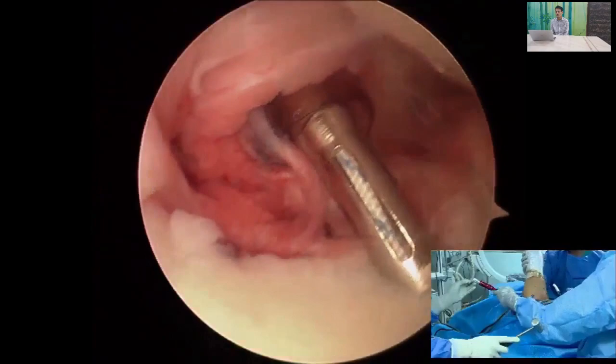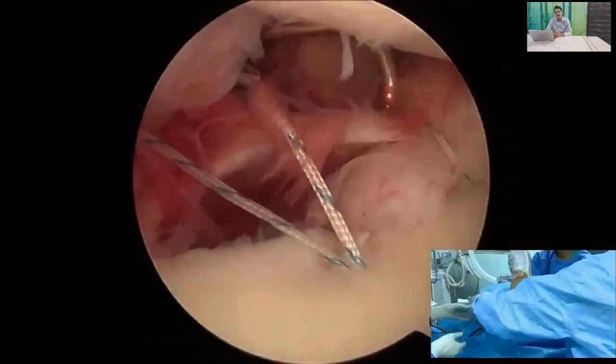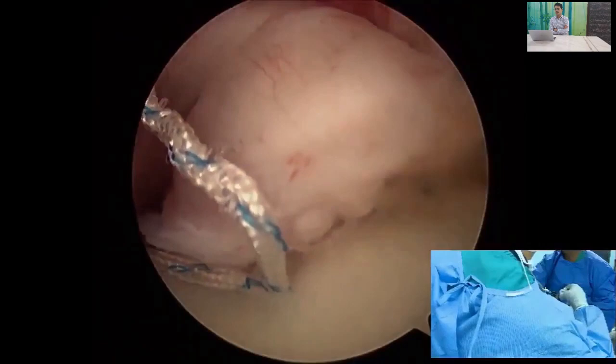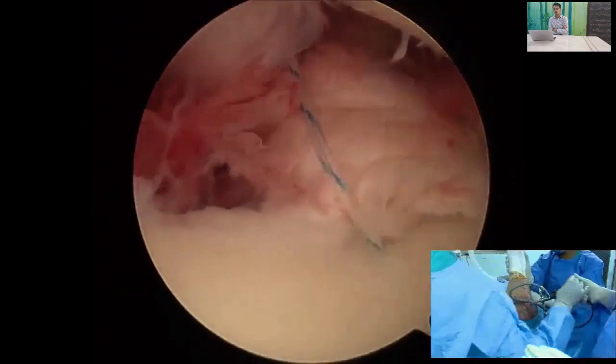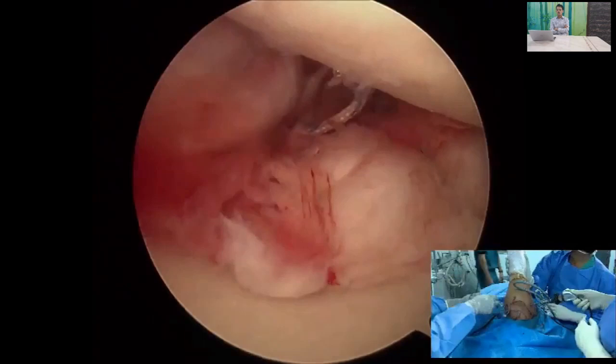For the third anchor, incorporate the capsulolabral complex as well as the capsule. In very unstable patients, you can occasionally incorporate a portion of the subscapularis tendon, although this is controversial. Again, the suture shuttle should exit below the anchor threads; railroad the anchor threads through the tissue and tie back to complete the capsulolabral repair, achieving a solid anterior repair.